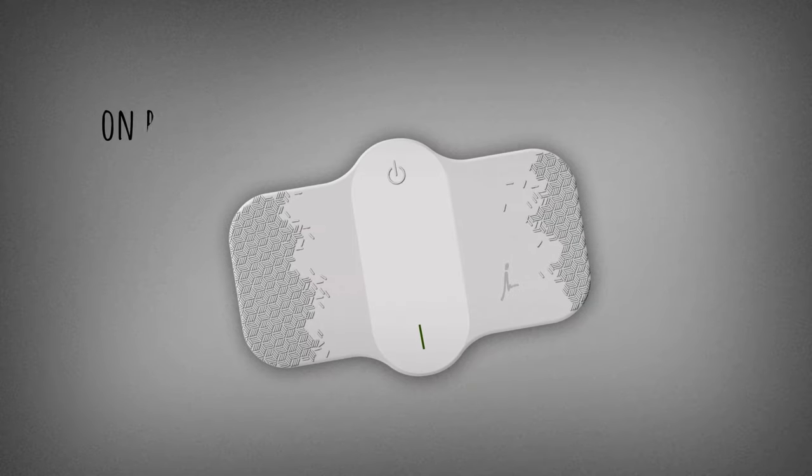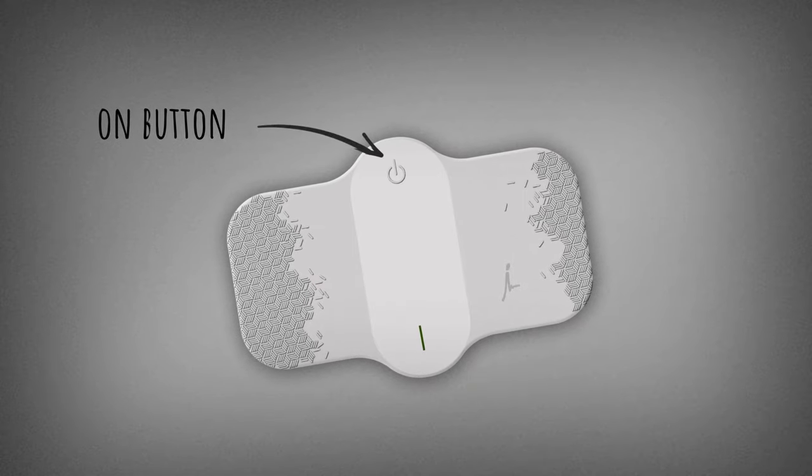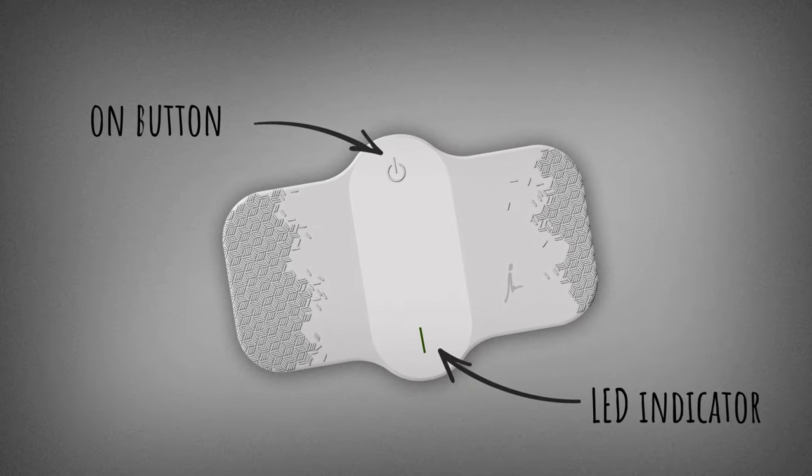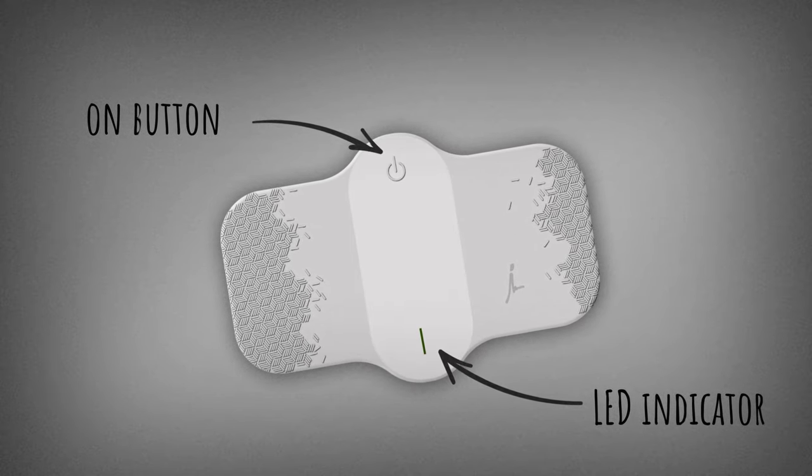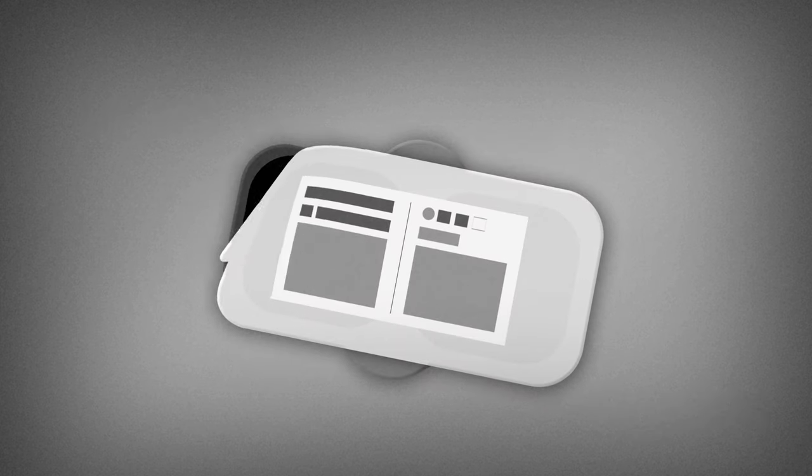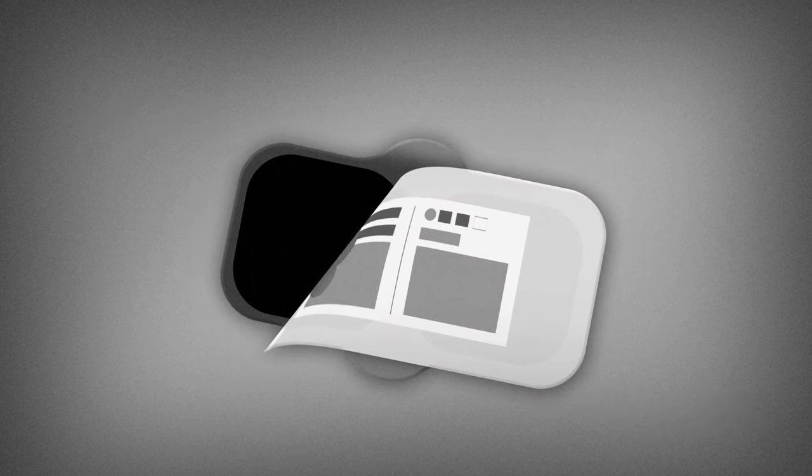The external side of the device includes an on button and a LED indicator. On the internal side of the device there are two electrodes covered with hydrogel and removable protective film.